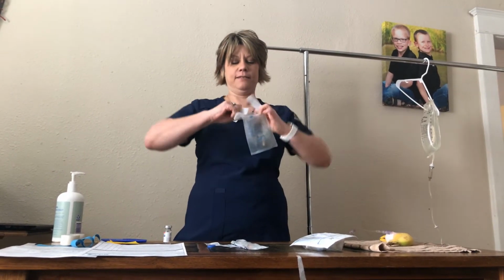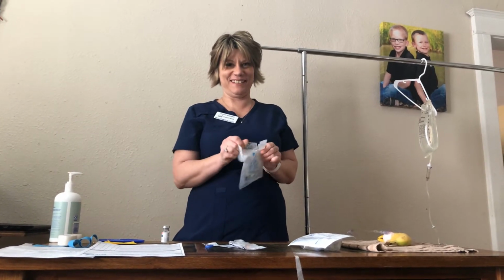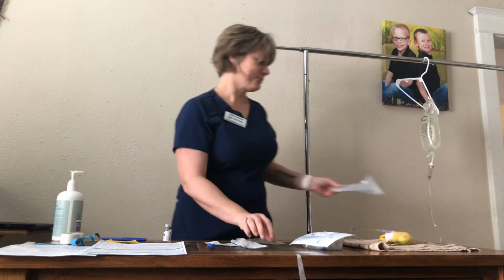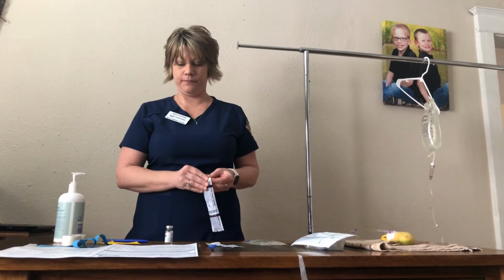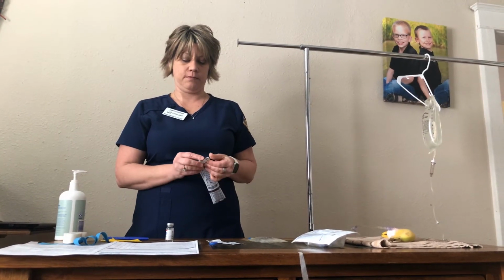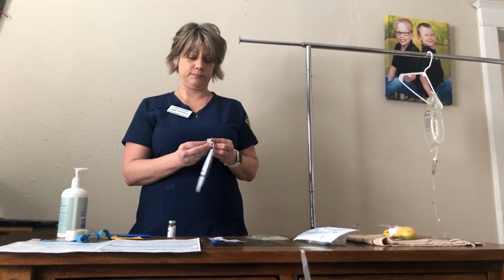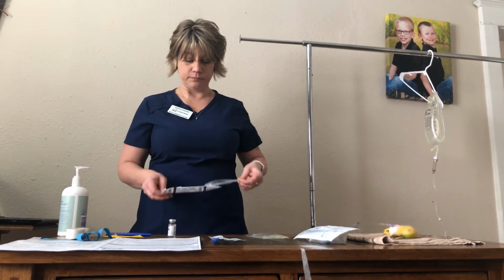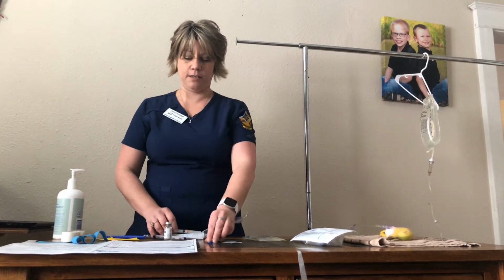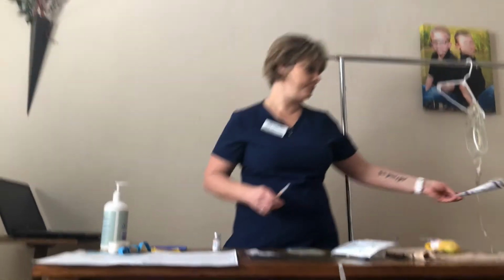I can open it the easier way. Alright, I've taken my lid off of my medication.